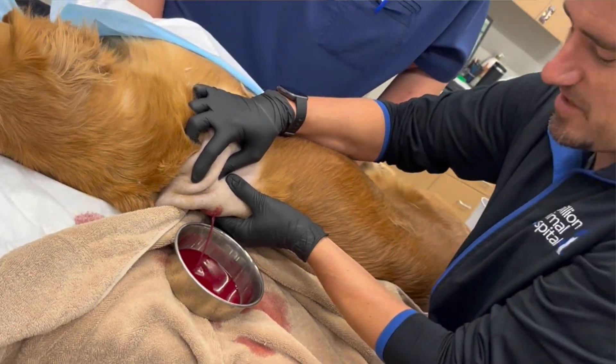Hey guys, my name is Dan. I'm a veterinarian and today I have a video where I'm going to show myself draining an abscess or infection under a dog's skin.